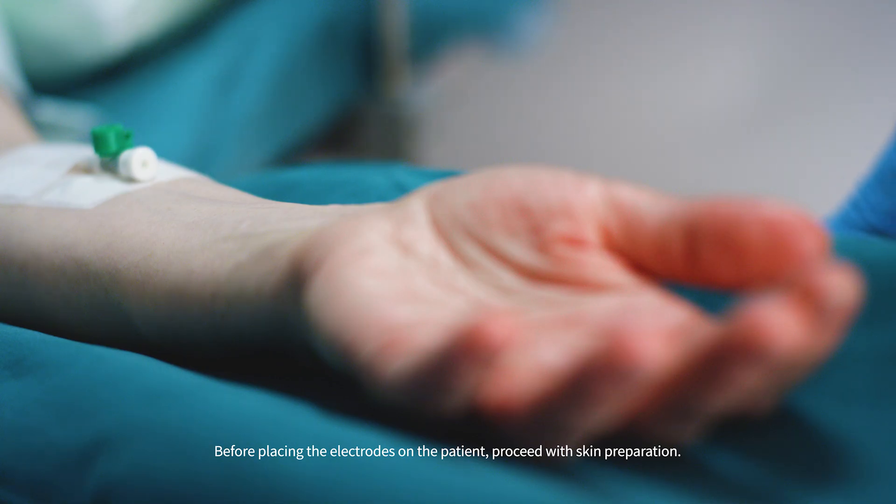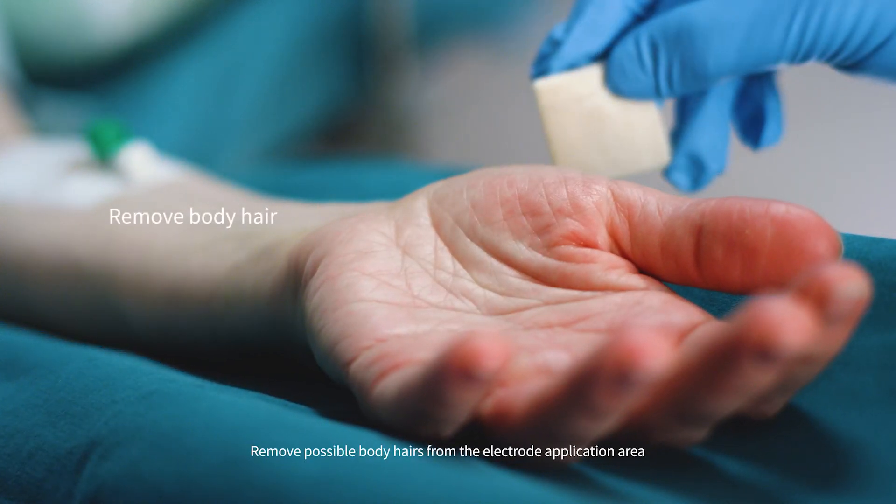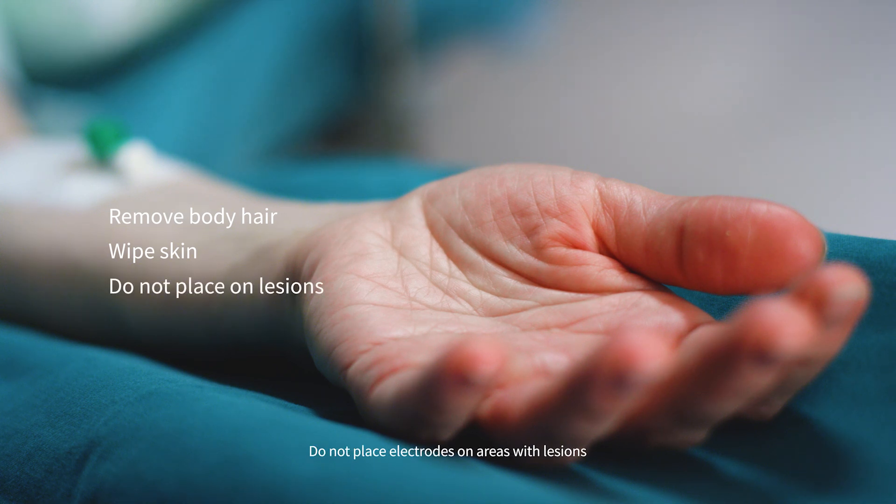Before placing the electrodes on the patient, proceed with skin preparation. Remove possible body hairs from the electrode application area. Wipe the skin with alcohol and let dry. Do not place electrodes on areas with lesions.